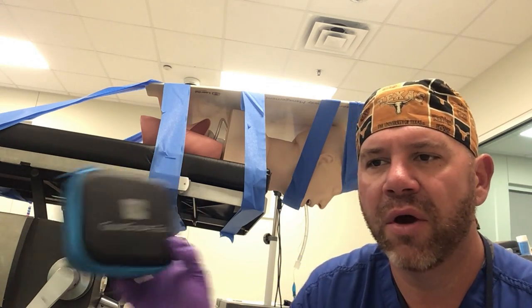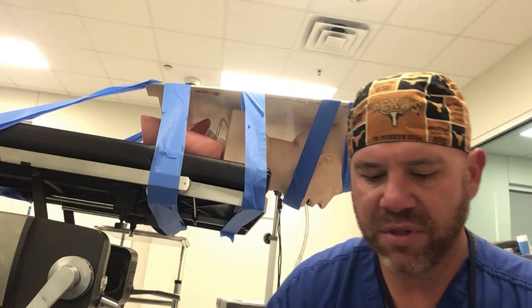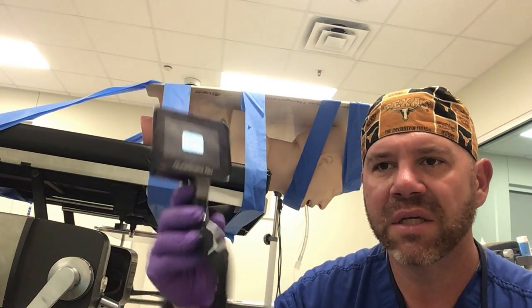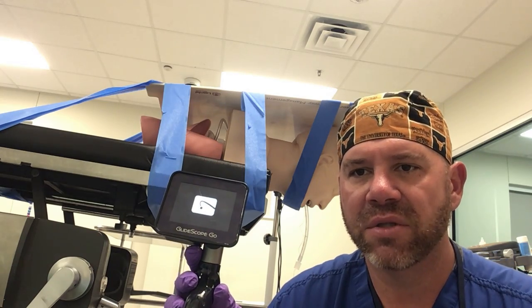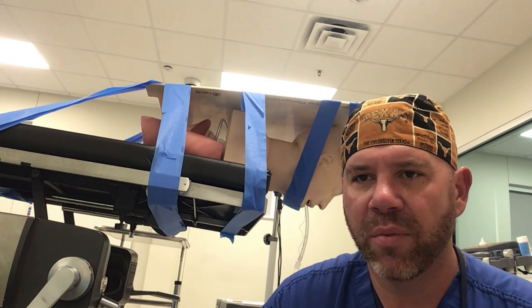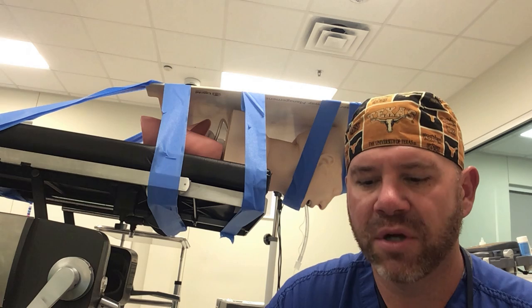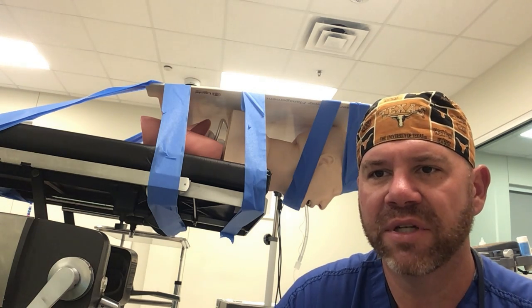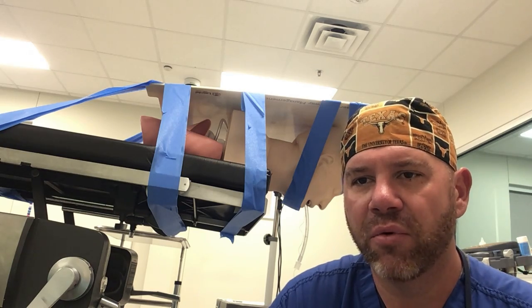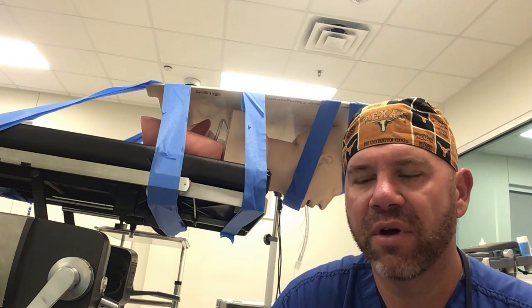For the use of the video laryngoscope, we're going to be using the Glidescope Go. The nice thing about the Glidescope Go is it provides you your screen as well as the laryngoscope in one piece, so you're not having to look anywhere else. Other things you'll need: an endotracheal tube with the proprietary Glidescope stylet. For video purposes today, I'm going to use the Glidescope Ranger just because it records for me and it makes life a little bit easier. But for actual patient care, I would recommend using the Glidescope Go so you don't have to look someplace else.